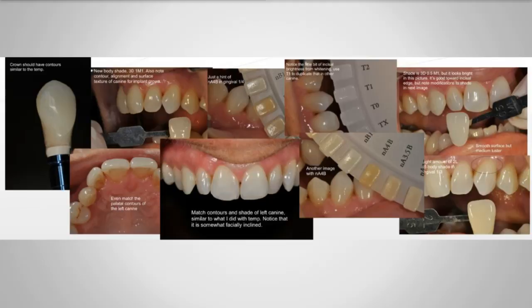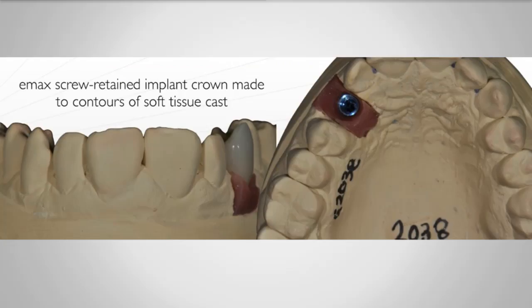What you can see here, I'm sending them a picture of my actual contour so they see that. My basic shade guides, I want them to shade tabs. These are the Noritake custom tabs, just lots of pictures. I take the pictures, I usually format them at night. It might have taken me 10 to 15 minutes to do that, but it comes back in spades. You really get nice color renditions when you spend that little bit of time.